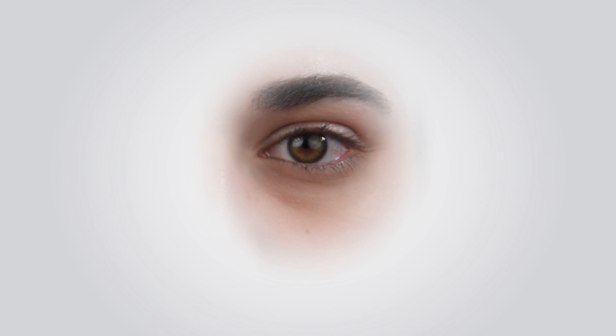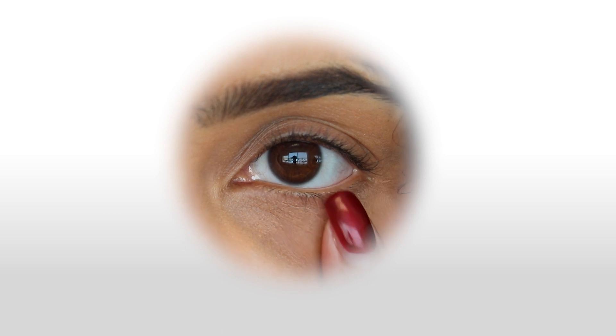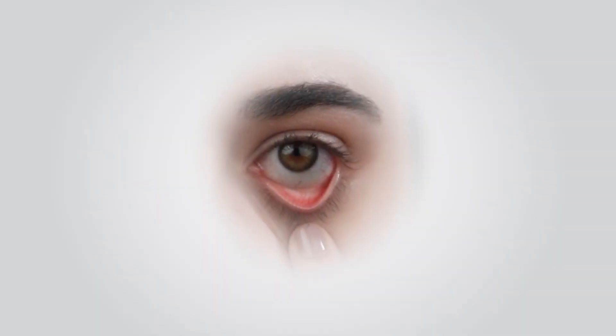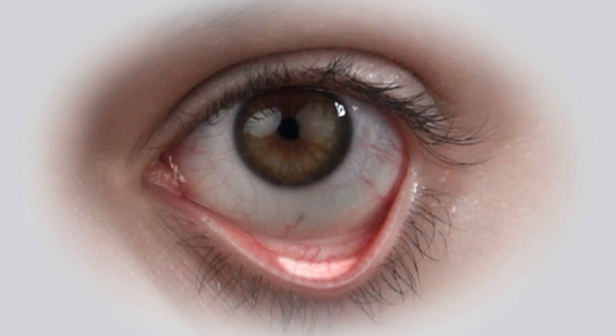Prior to taking a reading, ask the patient to gently squeeze their eyelids shut for 30 to 60 seconds. Hold the patient's lower eyelid down to invert the eyelid and expose the pocket. The highlighted area shows the conjunctiva where the eye pen sensor should be placed. Avoid touching the lid margin.